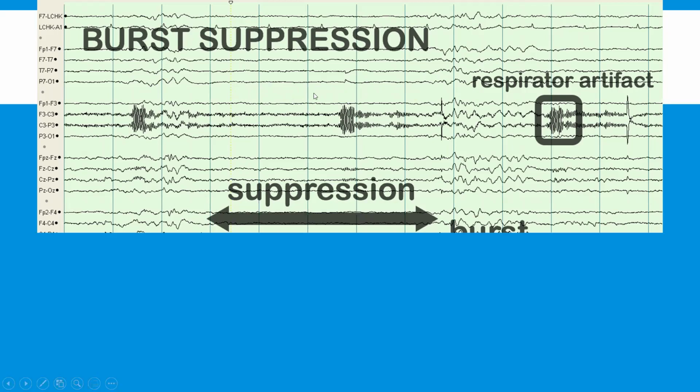Usually burst suppression is for patients who are sedated. A lot of times, if our patient is in status epilepticus, sometimes we put them in burst suppression. In the NICU, we increase the Versed, we increase the propofol until we reach burst suppression. So this is what burst suppression should look like. The burst should be about 1 to 2 seconds, and here you should have 4 seconds of basically flat EEG, and then you have another burst. When you see this, that means we're at goal, we've reached burst suppression.